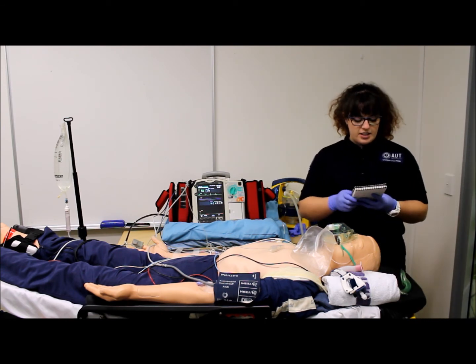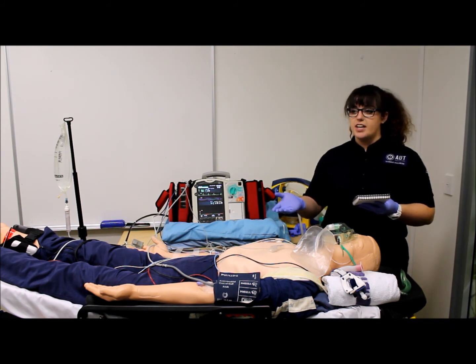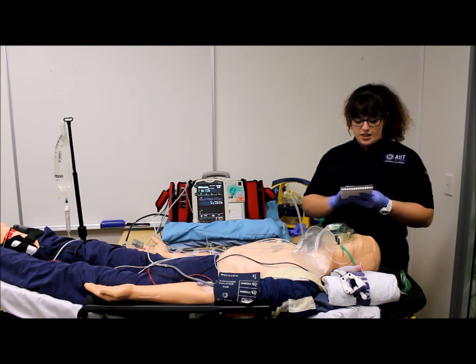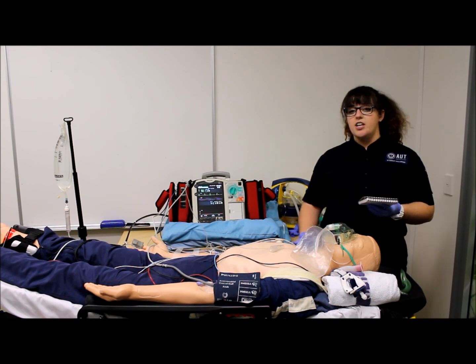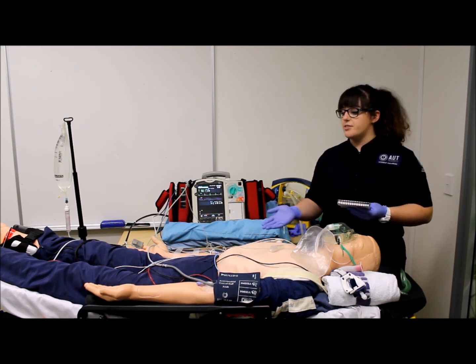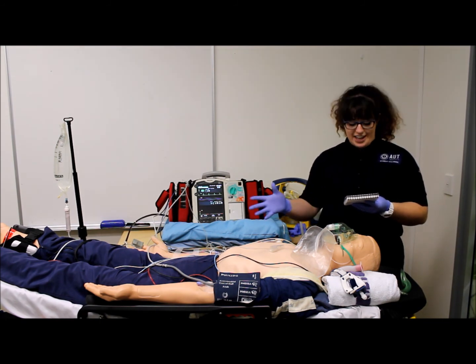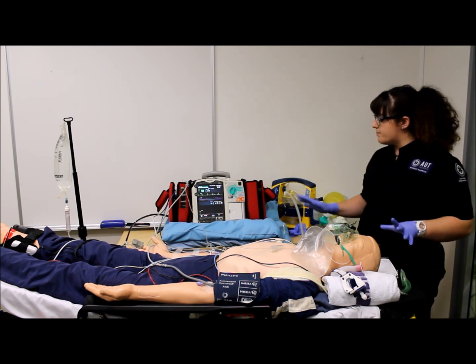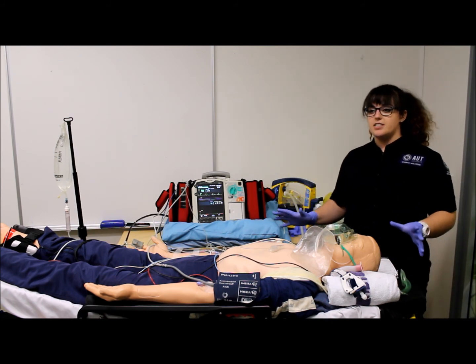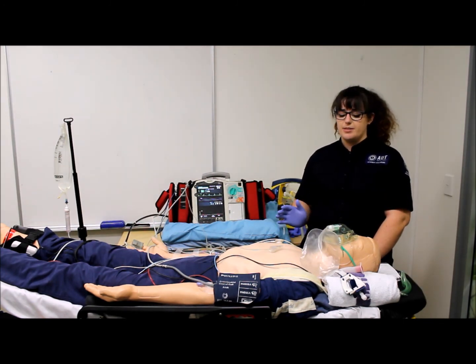We have obtained our first set of vitals, and we will continue to monitor that in another 5 minutes prior to our ICP's arrival. We will then obviously update our ICP of the patient's condition, which still looks the same, as well as doing another set of vitals. And then as we are in the ambulance, we have made sure that all our equipment is placed nicely and there is no unnecessary clutter area. So now our RSI checklist is complete.